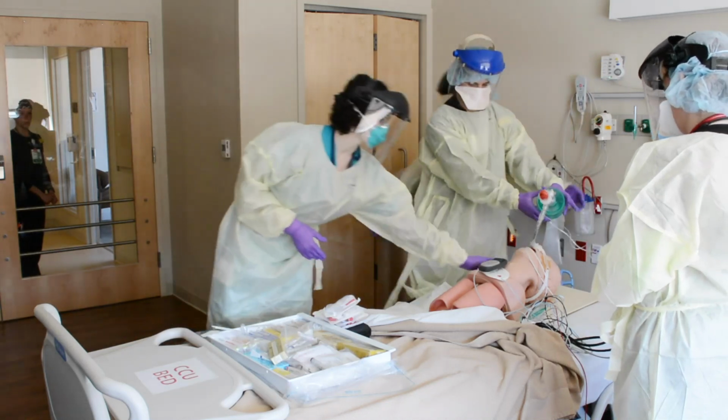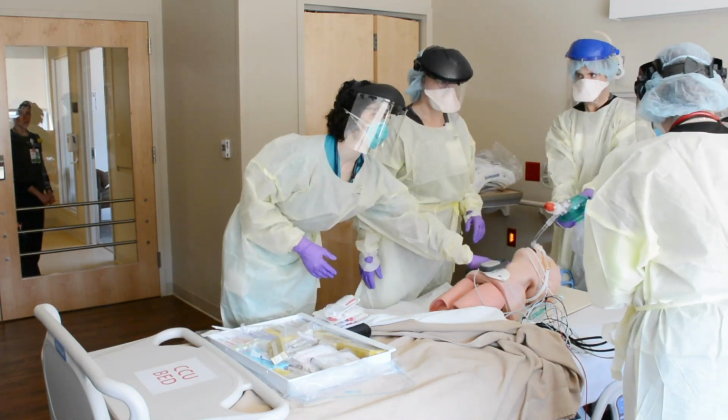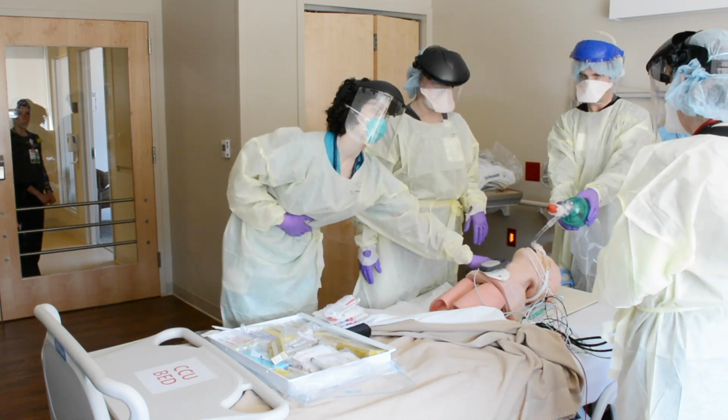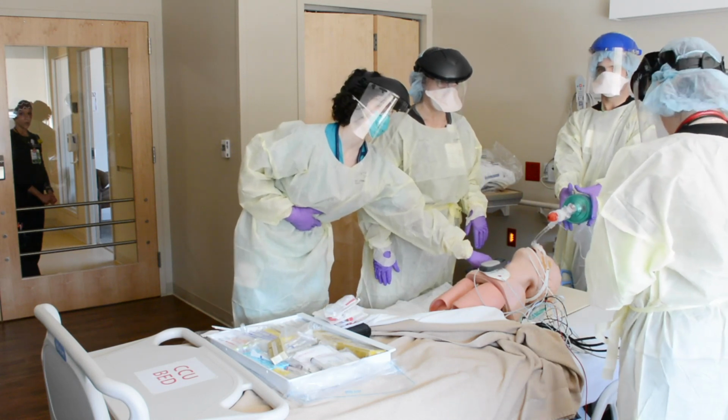10, 9, 8, 7, 6, 5, 4, 3. Once return of spontaneous circulation is achieved, prepare for transfer of the patient.